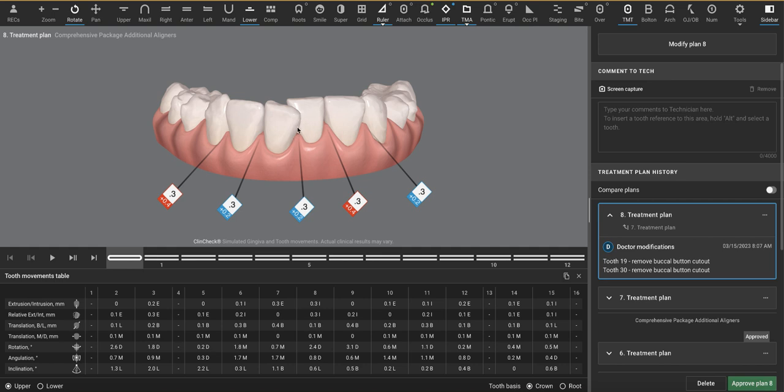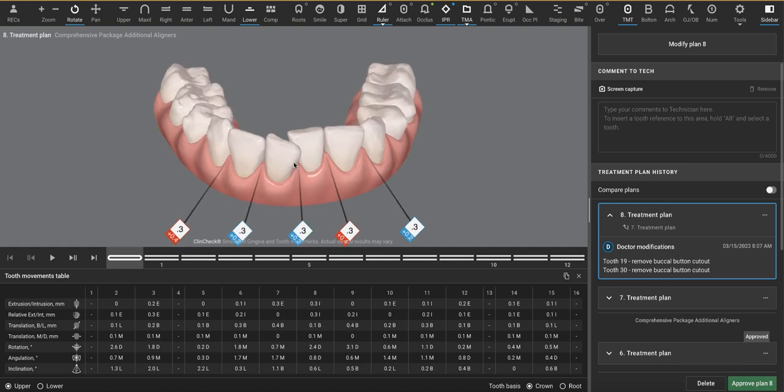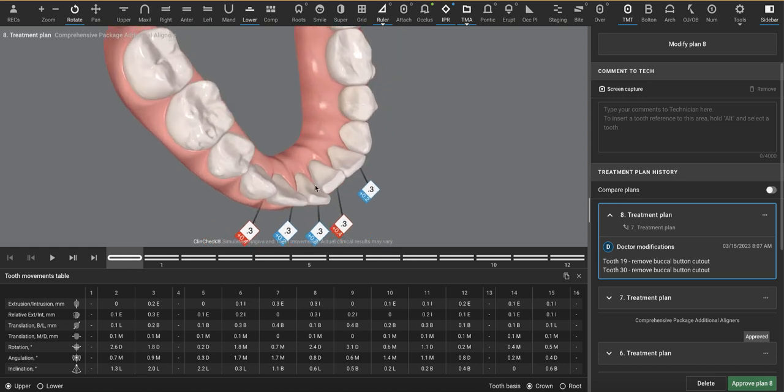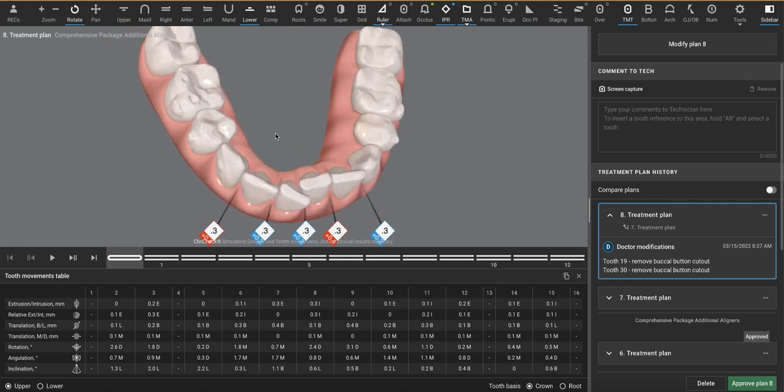856-012 burr, just like a diamond crown prep burr, and reduce that, and then reduce that. You don't have a whole lot of control because of the space constriction here. You're not going to get 100% of the IPR down in this area here. So I don't like doing IPR on teeth that are crowded, especially this crowded.